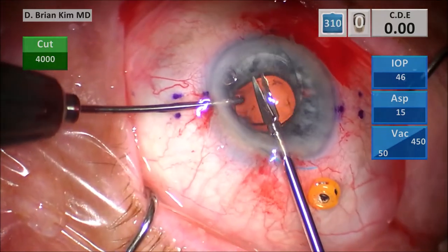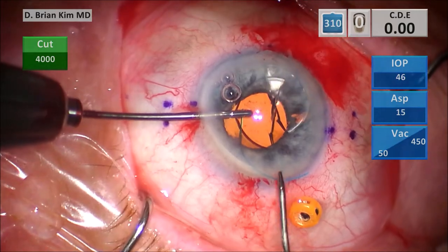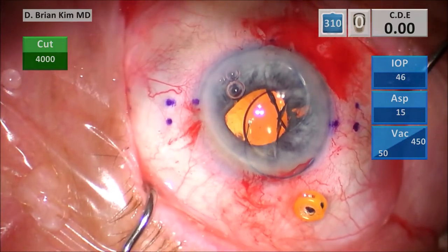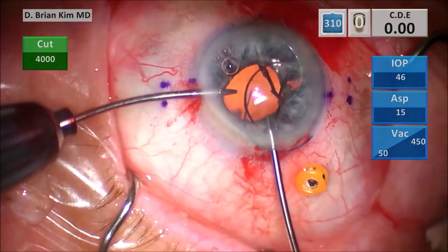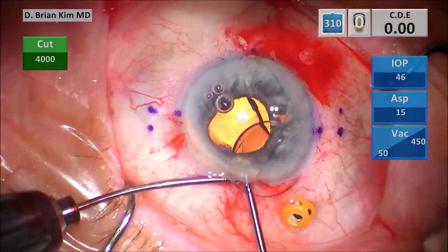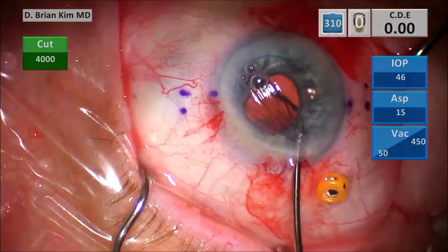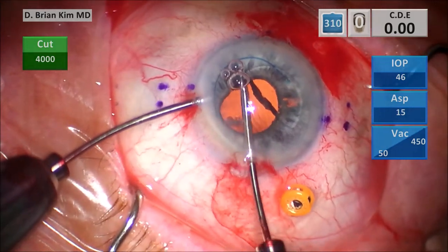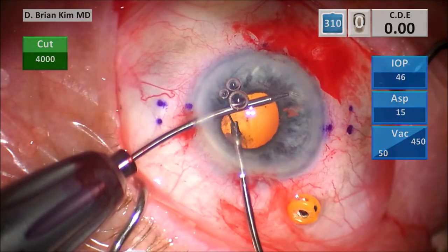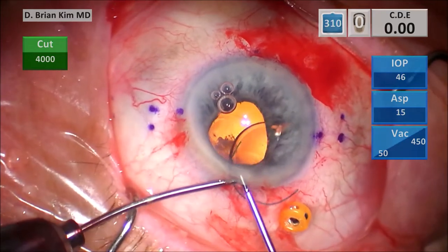Now I have my serrated forceps grabbing it with the left hand, cutting the lens in half with the scissors in my right, then switching my right hand for forceps. I'm trying to grab it, but this must be a silicone lens — it's a little slippery — so I'm switching hands to the serrated forceps in my right hand. It's kind of drifting off, so I'm grabbing the haptic with the left and then grab the lens with my right hand. That piece came out pretty easily. Going after the right side now — the optic is kind of slipping away, so I grab the haptic with my right hand, rotate the lens piece a little bit, and I was able to take it out pretty easily.